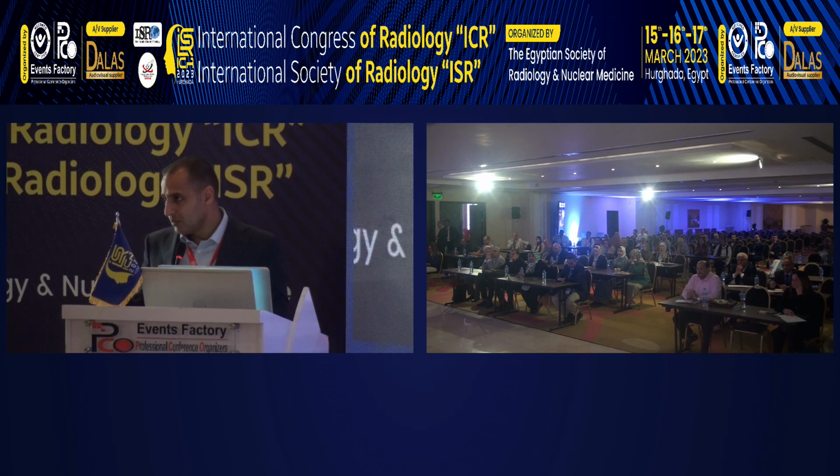But if you are asking for my opinion on whether to use it or not: if there is any problem with renal impairment, we will not start with contrast in old age. So we have criteria. But if there is a patient with suggestive symptoms or suspected adhesive capsulitis and no renal impairment, I would strongly recommend the use of contrast media. I cannot show you, for example, 40 cases, but in those 40 cases we had the same scenario.